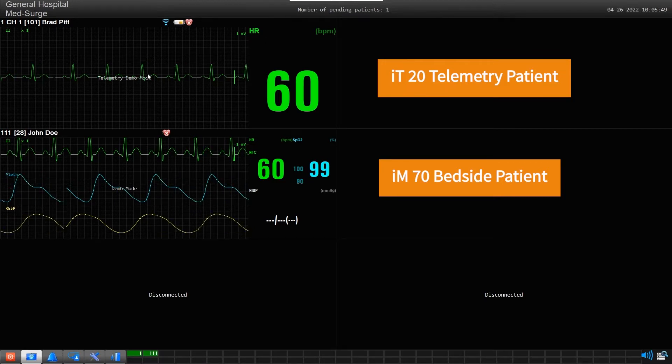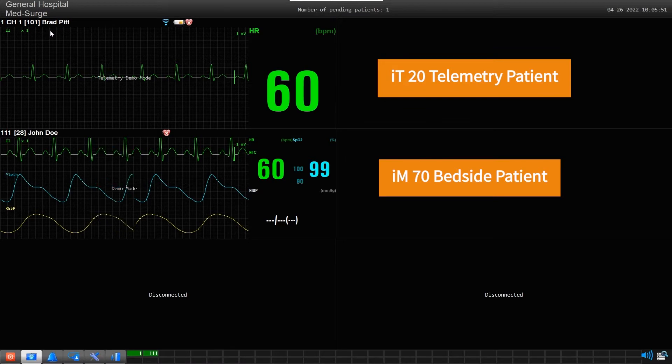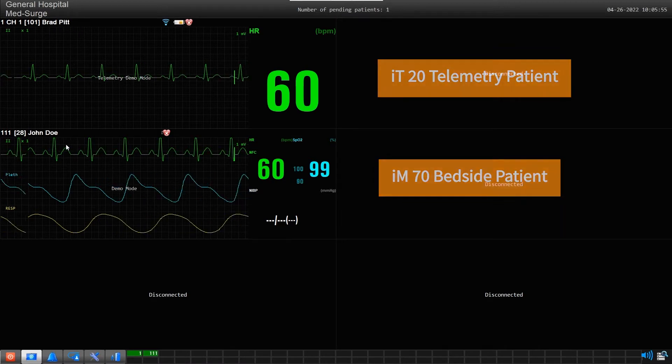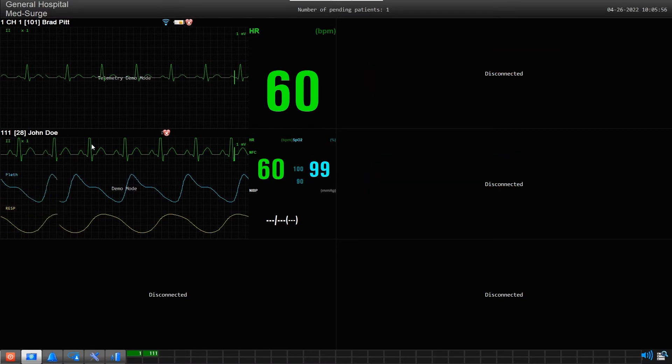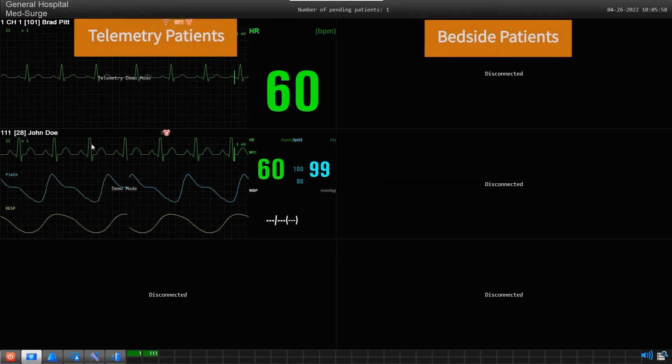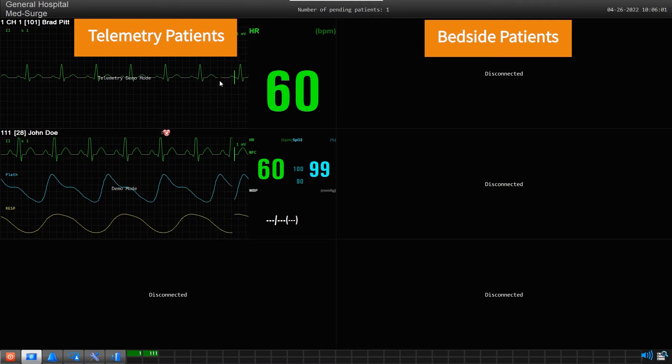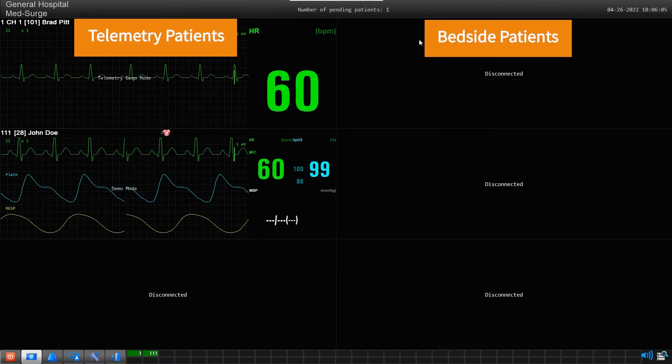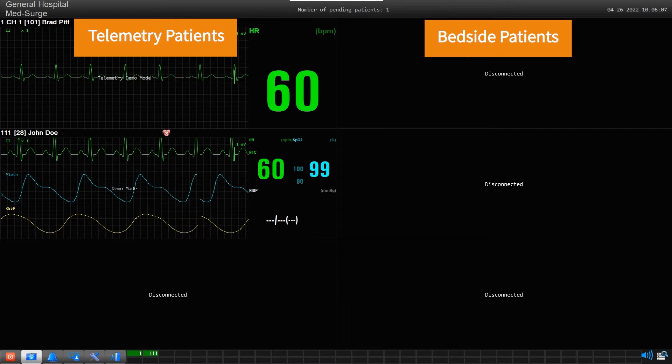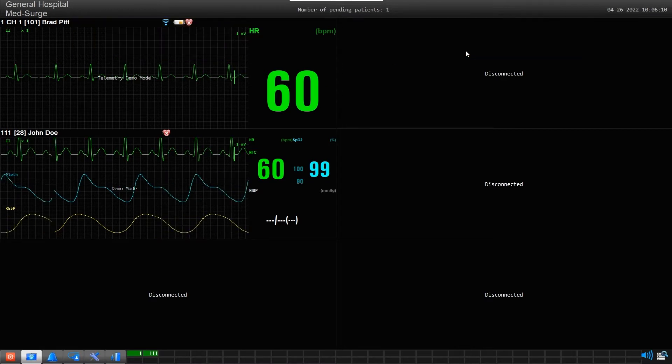This one is an IT20 telemetry patient, and this one is an IM70 bedside monitor patient. If I decide that I want to display telemetry patients on the left side of the screen and display bedside patients on the right side, then I can move this bedside patient from this left-hand slot location to a slot location on the right side.